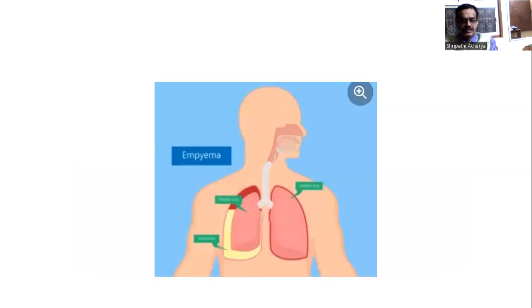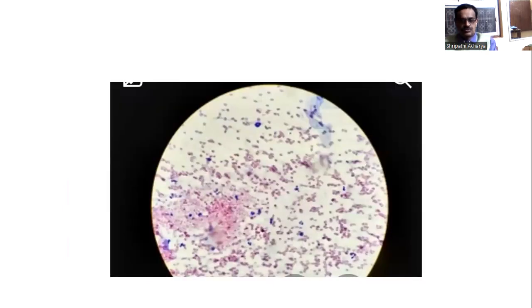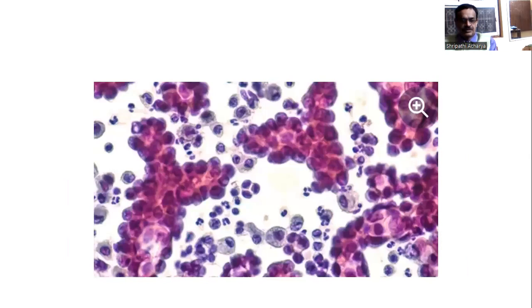You can see on the right side there is an effusion, and the fluid under the microscope. So here, on the left side there is a microscope. For the microscopic picture of the fluid, you can see inflammatory cells, chronic inflammatory cells, lymphocytes. Lymphocytes are chronic inflammatory cells.